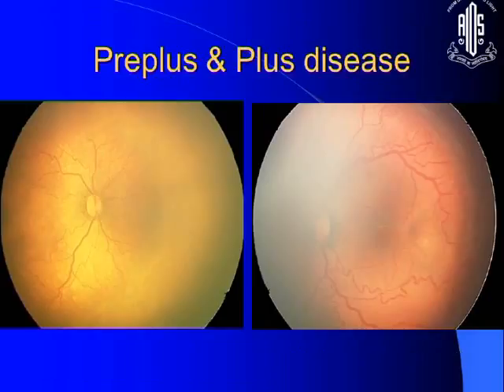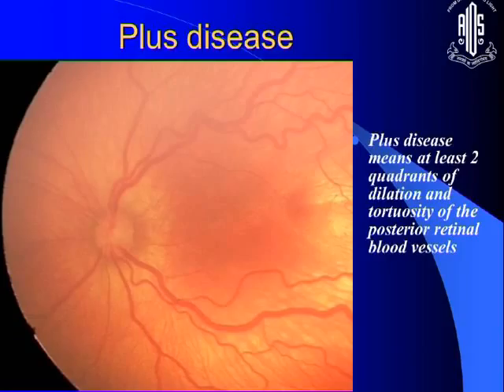Yes. So you can exactly see the pre-plus and plus disease, document it, even look at the progression. And if you take this kind of a picture, anybody who's going to look at it will know that there's a very serious disease going on.